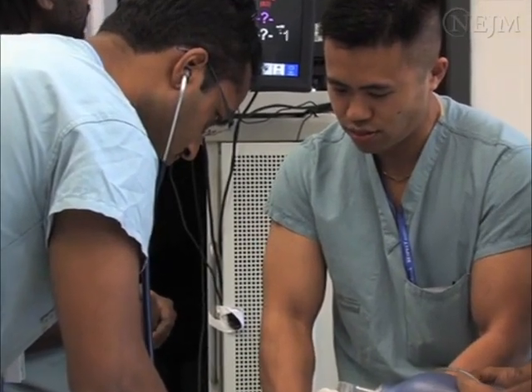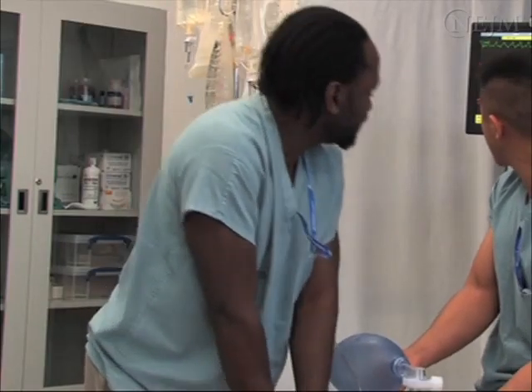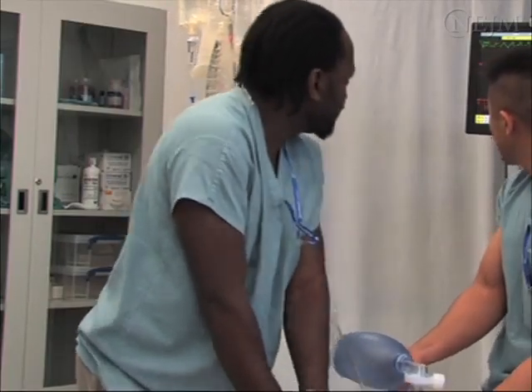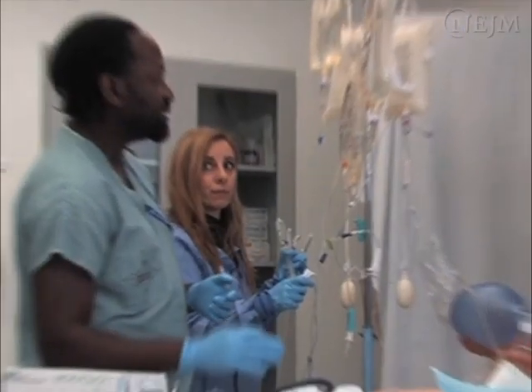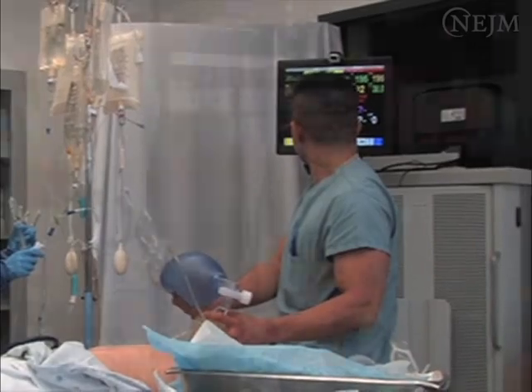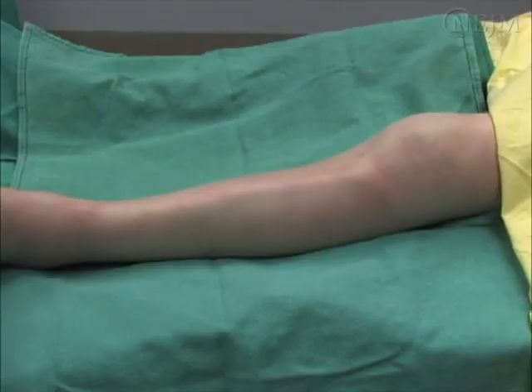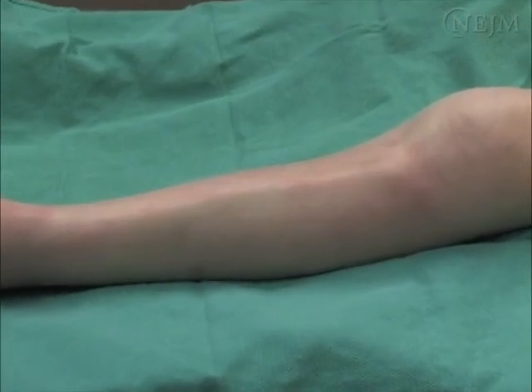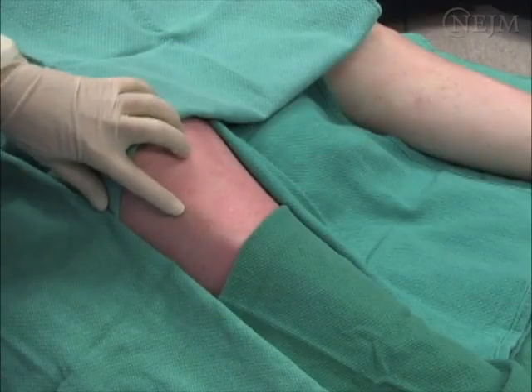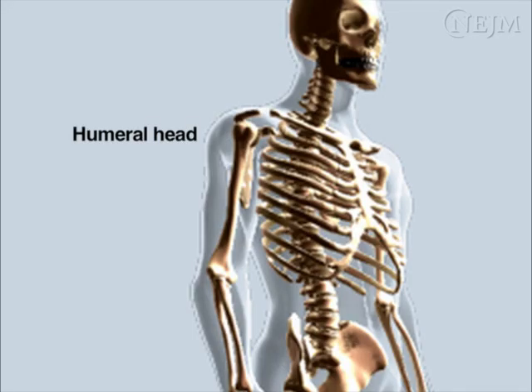Obtaining intraosseous access is an emergency procedure. Consequently, it is rarely possible to obtain informed consent before performing the procedure. If possible, explain the risks and benefits of the procedure to the patient or the next of kin. Otherwise, proceed with insertion. When a mechanical device is used, the proximal tibia is the preferred site in adults. Secondary sites are the distal tibia and the humeral head.